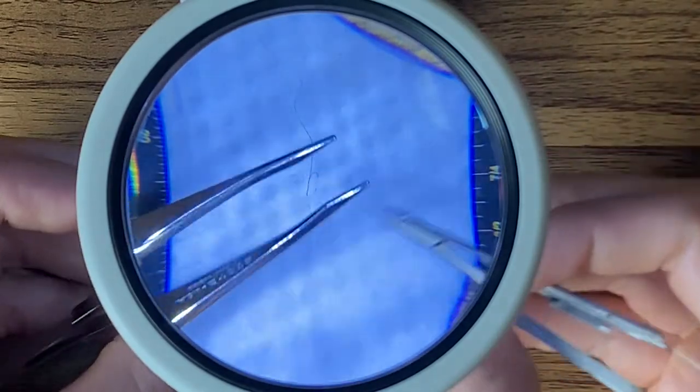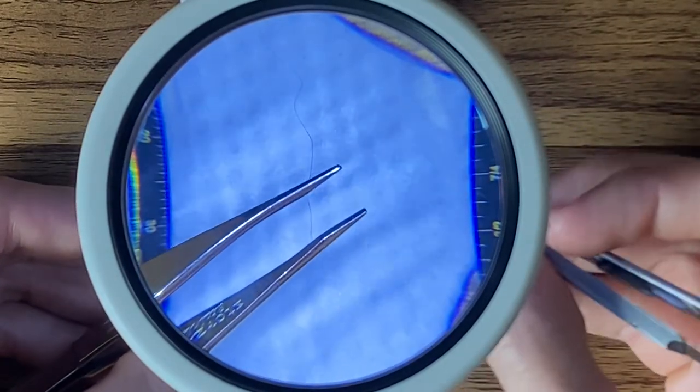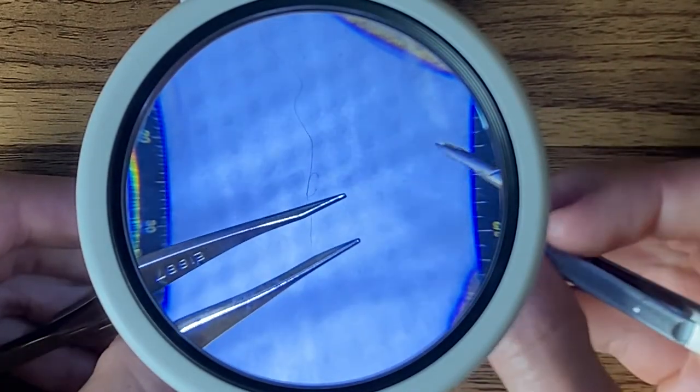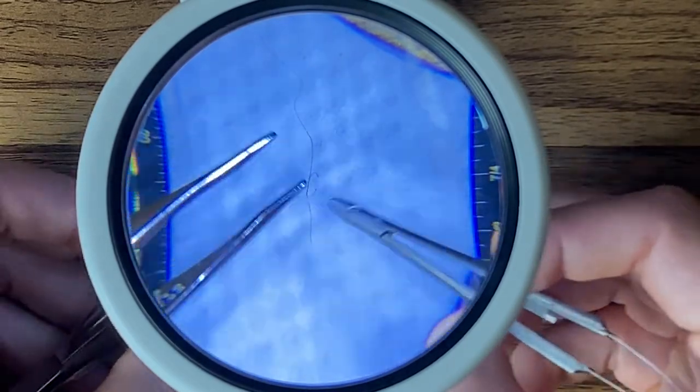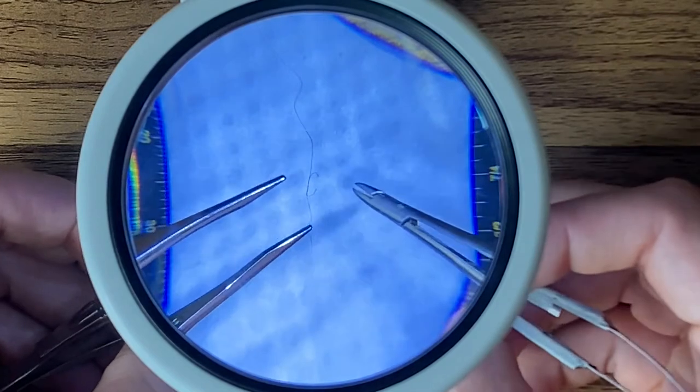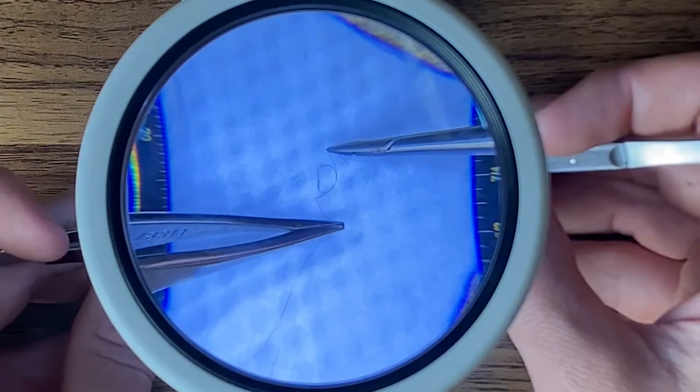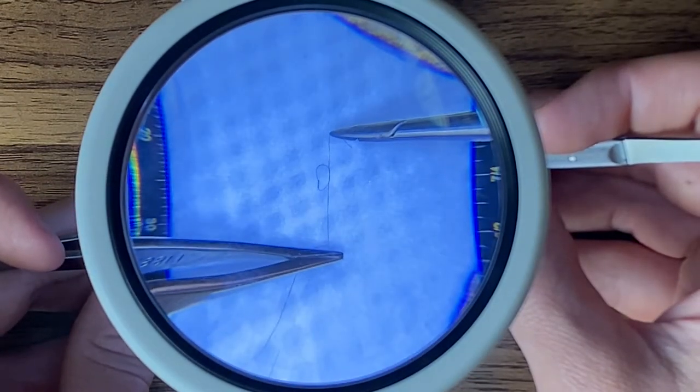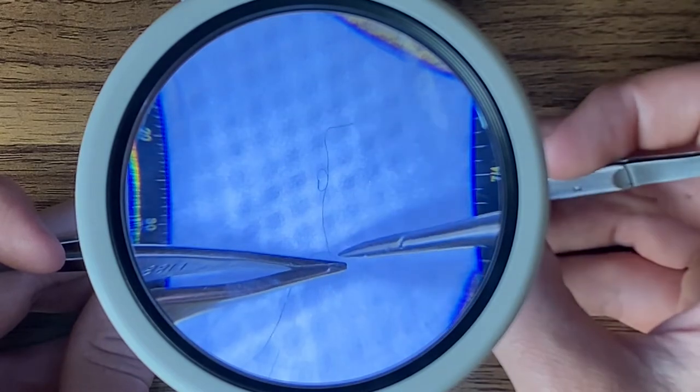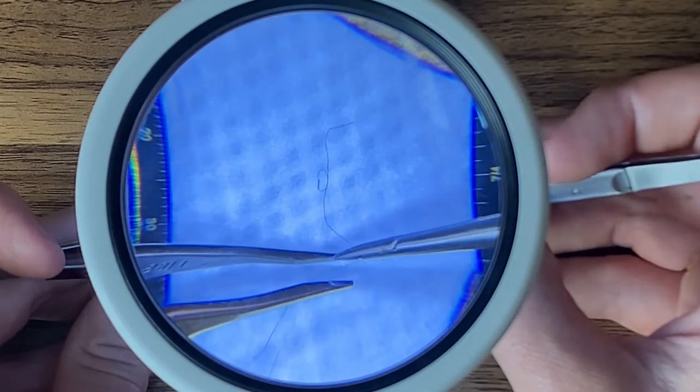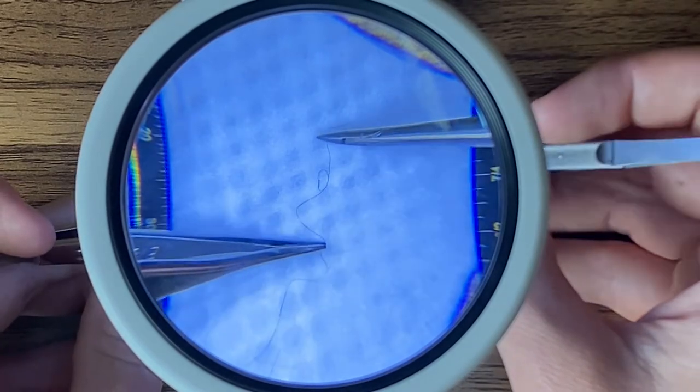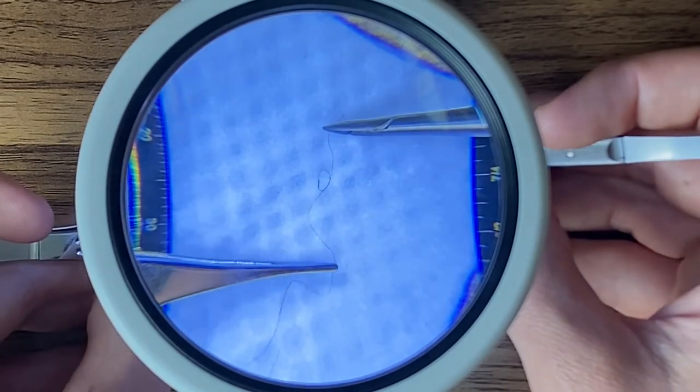So the answer is pretty simple. The edge of the jaw of the forcep is a 90-degree turn and it's essentially a dull blade. So if you rub this fragile suture over this dull blade, it's gonna cut it. So here we are cinching down this knot here, but instead of draping this suture over the dull blade, that is the edge, the 90-degree edge of my forcep here, I want to turn it 90 degrees.